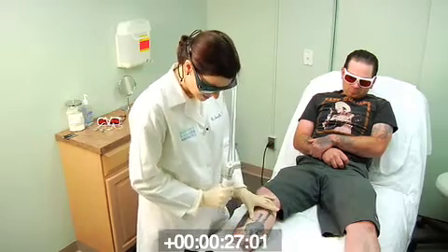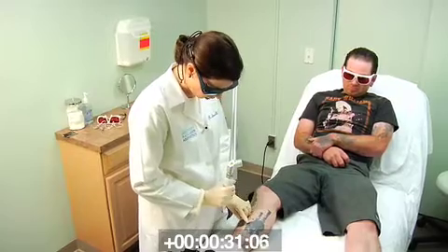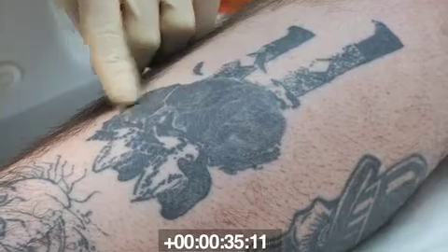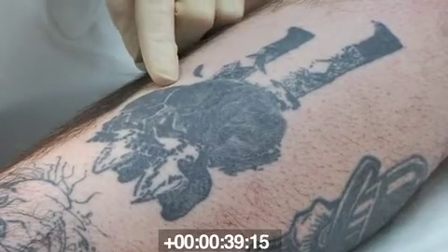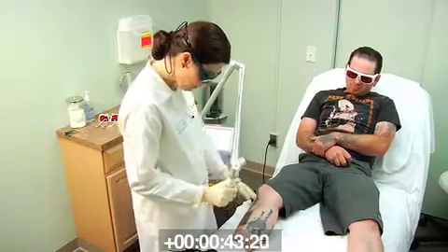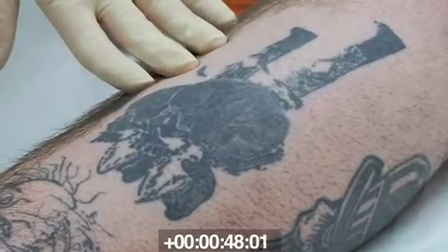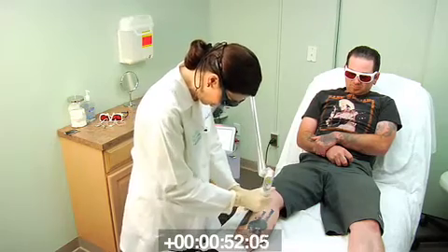We're going to start with the 1064 nanometer wavelength here because that is ideal for black ink such as this. And because there's quite a high density of ink in this tattoo, we're going to choose a low fluence for our test spot and go up from there as needed. My endpoint is a crisp white spot without pinpoint hemorrhages. And I'm going to do a little test pulse right up in here.